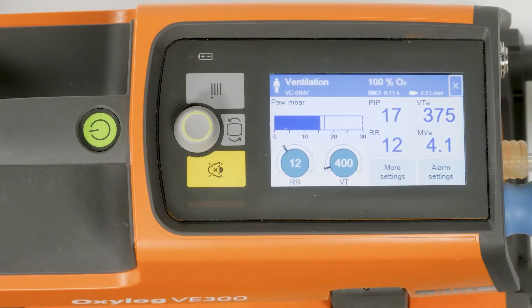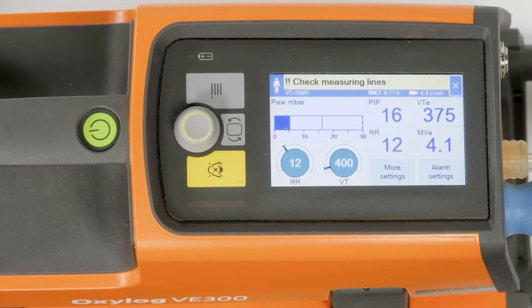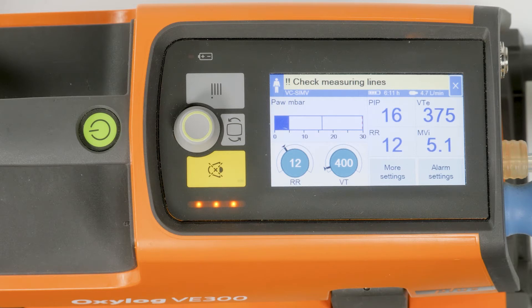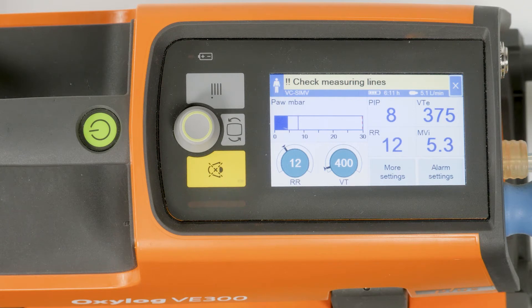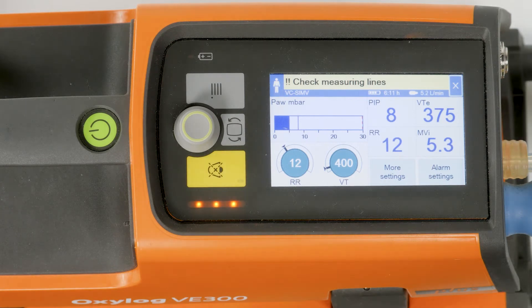A medium priority alarm is highlighted by two prefixed exclamation marks. The alarm indicator flashes yellow. The acoustic alarm consists of three tones, repeated about every eight seconds.